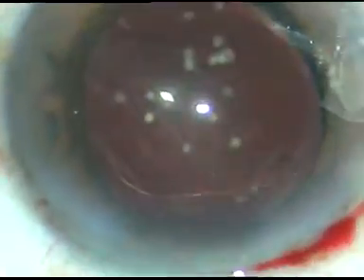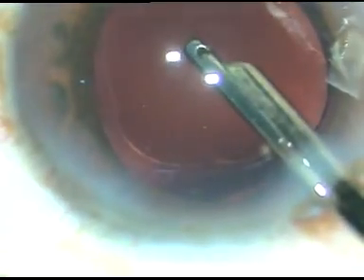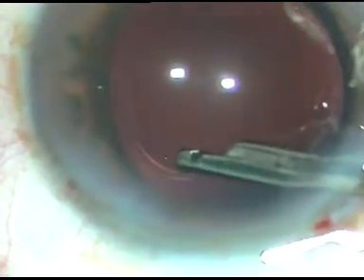This is moxifloxacin. The side ports — the stab incisions — are closed by hydrating the corneal stroma on either side of the openings. See how beautifully the viscoelastic substance from the corneal endothelium comes out at higher magnification. These are the viscoelastic substances which got stuck to the posterior aspect of the cornea, that is the corneal endothelium. In this view we can see the rhexis — it tended to go to the periphery at 2 o'clock and has been nicely retrieved. The anterior chamber is formed and the case is closed.